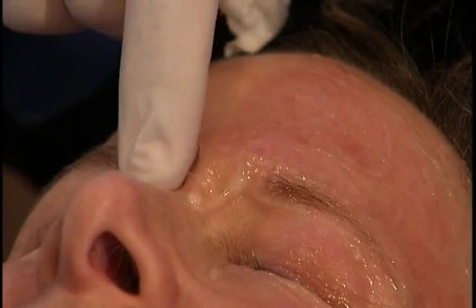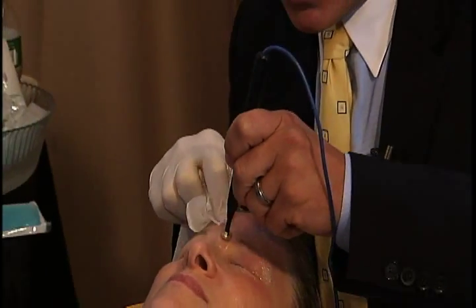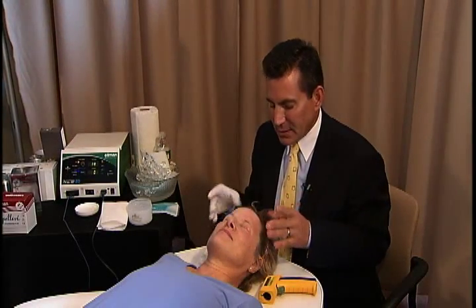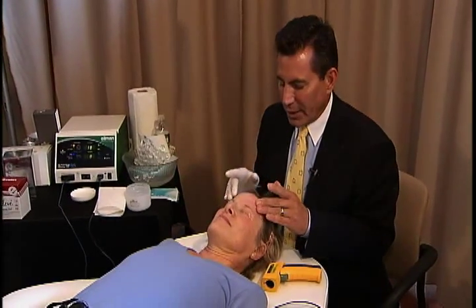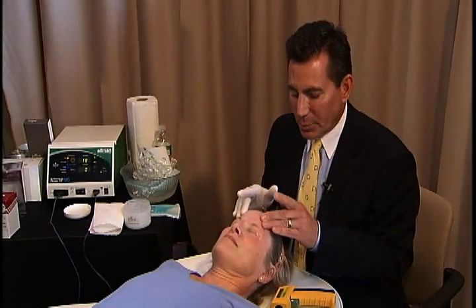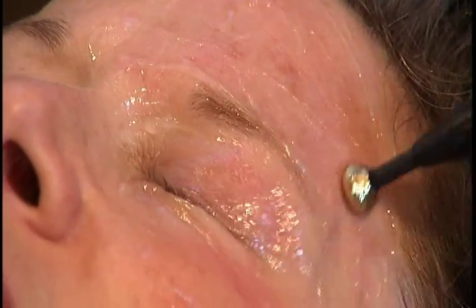On the glabella, remember, she has a low horizontal line there, so I want to draw up. I want to draw up on that glabella and tense it so that I can get some energy down there without gapping. Just 2 passes in a relatively thin forehead. I'm going to feel the tissue, and I can feel that this is a lot more dense than this is. When I move the tissue, this is a lot stiffer than this. So I'm getting the firming. And again, you see me moving a little faster now because I know she's getting up there temperature-wise. So I move faster so she tolerates it.